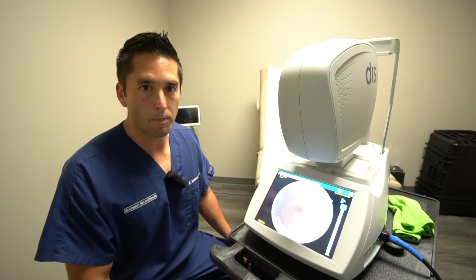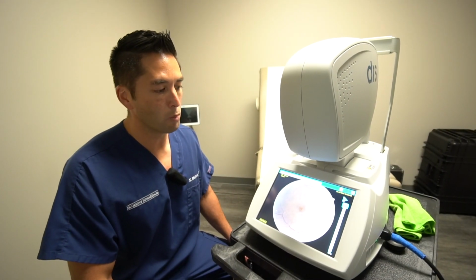called fundoscopy. Fundoscopy is an exam where we use a little fundoscope, a little tool that we can look inside the eye of the patient with the lights off, and what we're trying to capture is a view of the back of the eye by looking in the patient's eye. And why do we do that? Well, there's a lot of reasons.